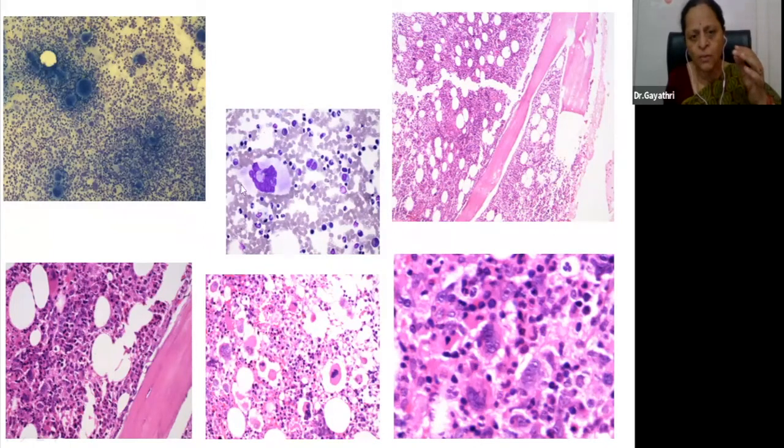Like, see, this is lobulated, but it has nice mature cytoplasm, faintly staining, candy floss-like cytoplasm. These megakaryocytes almost look like giant cells, metastatic giant cells. If you are fond of histopathology, they look like that.